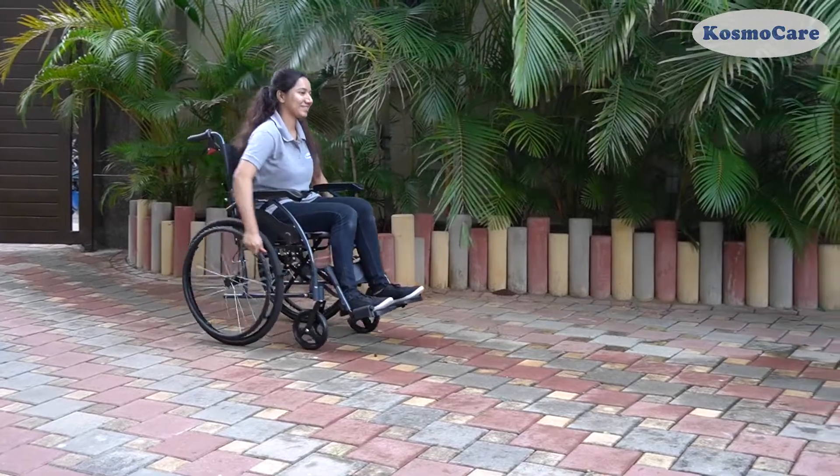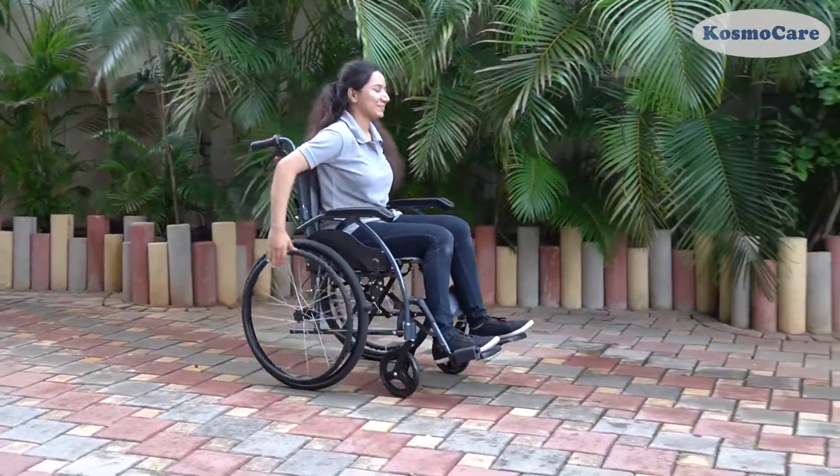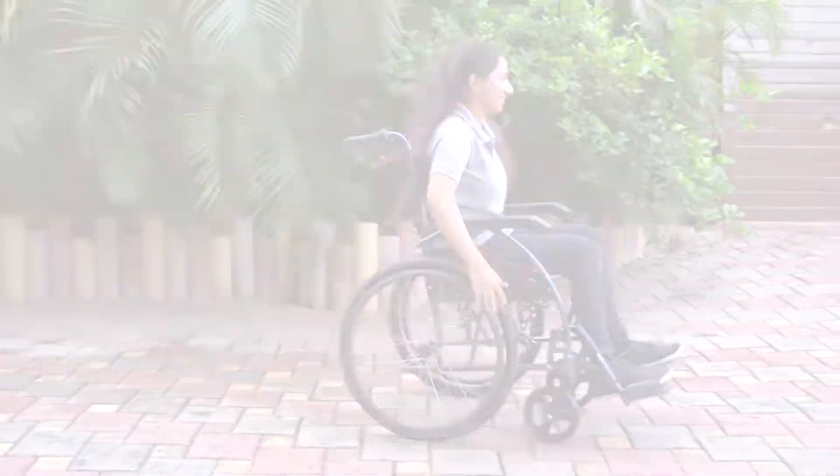So, give your loved ones the convenience and freedom they deserve, with the Elegant Breeze Wheelchair from CosmoCare.